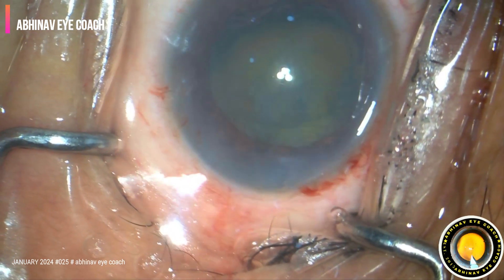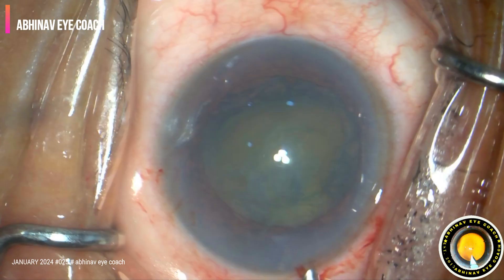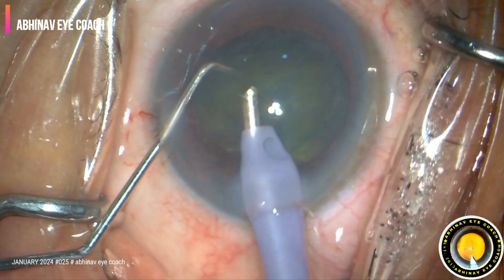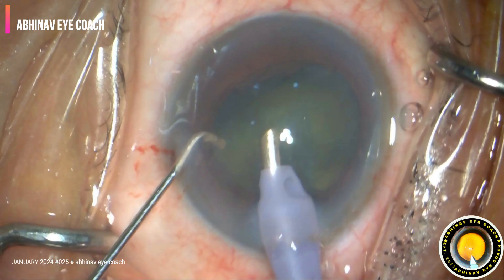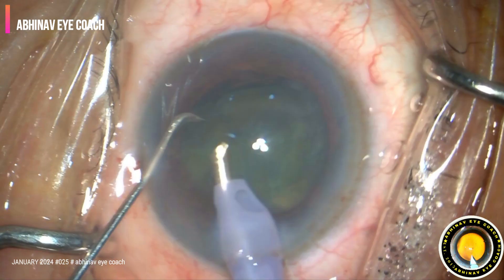Flip and chop is a very useful technique in such kind of cataracts, because back chop, direct chop, or divide-and-conquer — all those techniques are not efficient in soft cataracts.